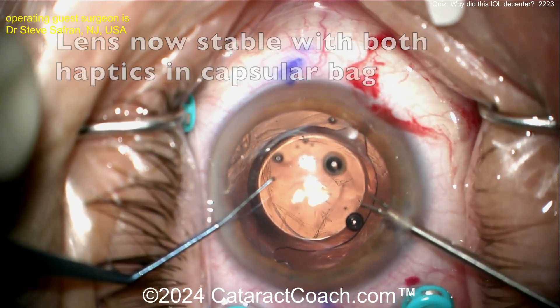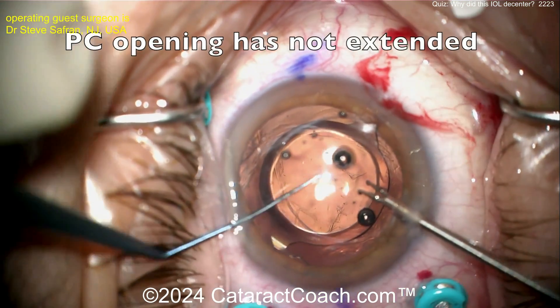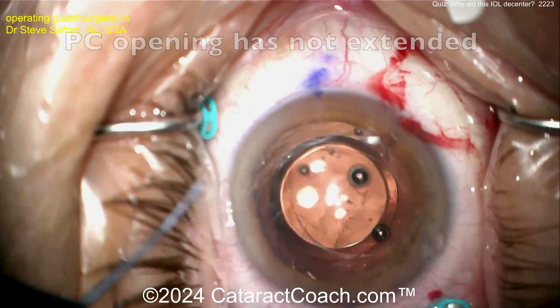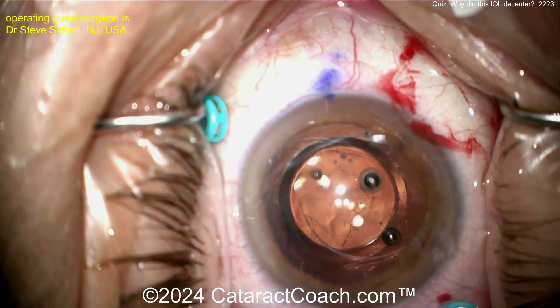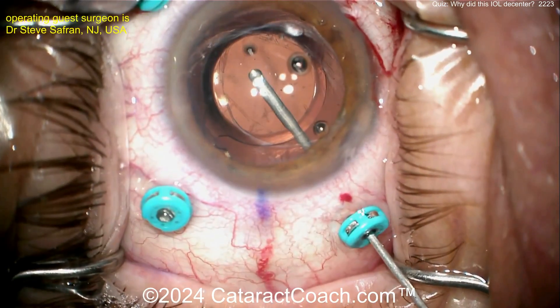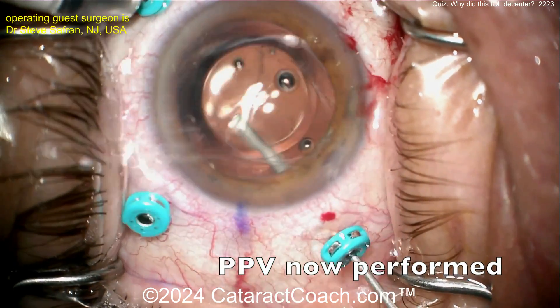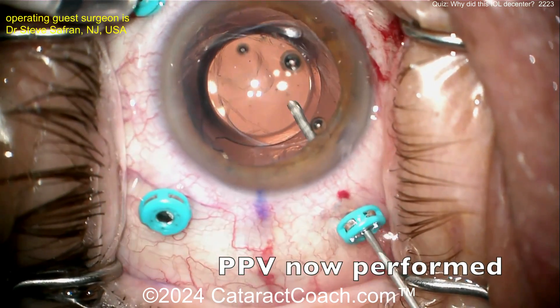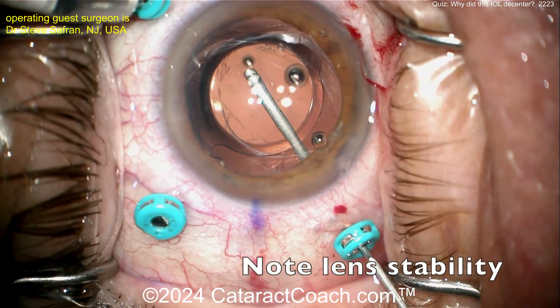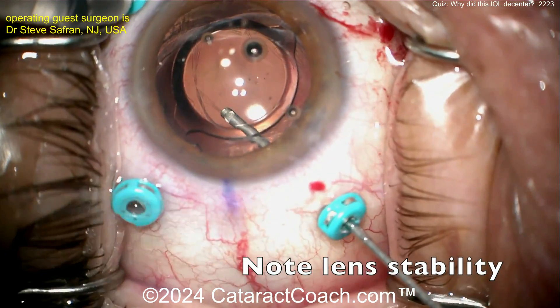The lens has been rotated a few clock hours and now both haptics are easily in the capsular bag. The lens is very stable and won't rotate. This lesson is clear: you cannot place a single-piece acrylic lens in the sulcus, and that includes in-and-out syndrome — you can't have one haptic in the bag and one in the sulcus, as it will de-center and cause problems.